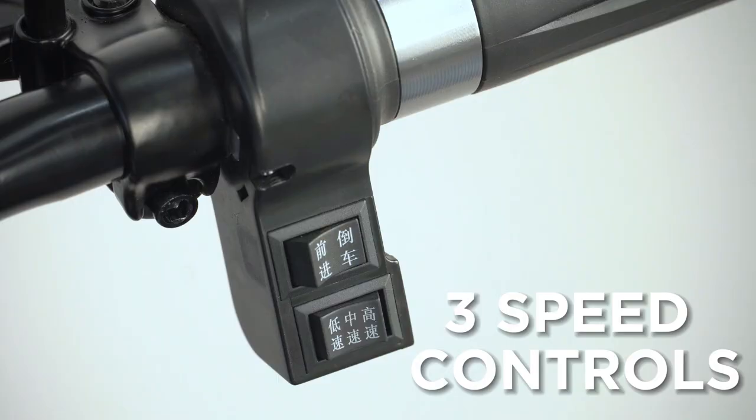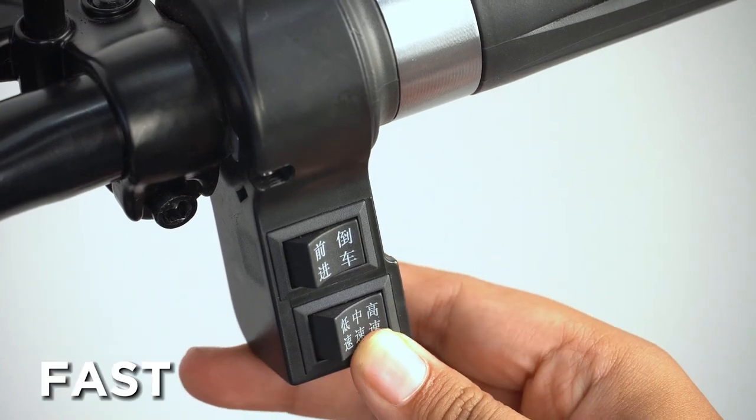There are three speed controls: slow, moderate, and fast.